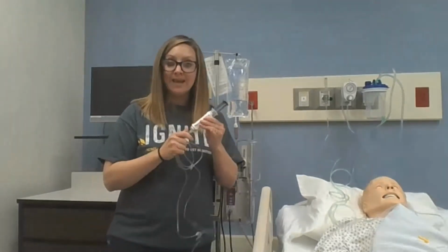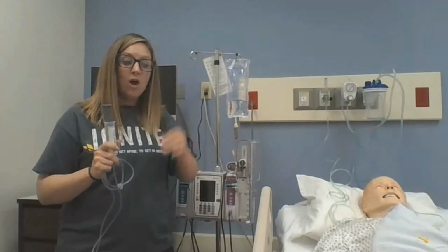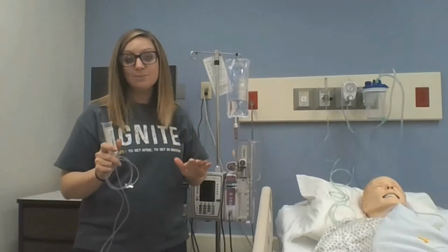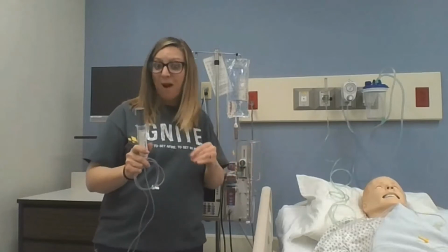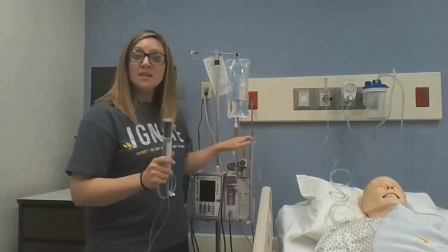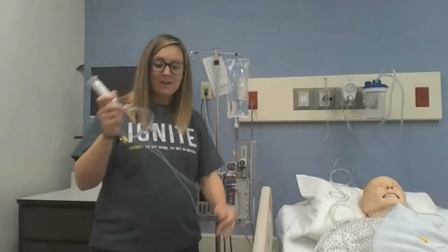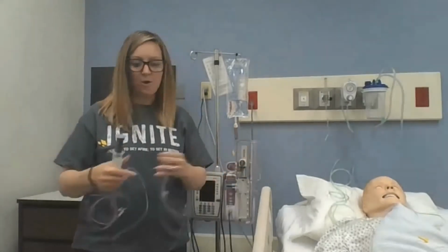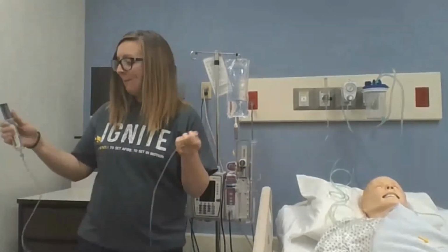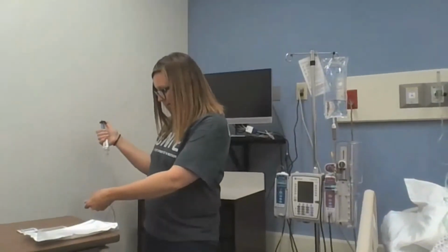You can manually prime these, or you can prime them from the pump. So it just depends on if you need to use very specific measurements. Maybe your patient is critical and you need to account for every last drop of that medication. Then you'll prime your tubing with your pump. But you can also manually prime it. Just make sure that you're not wasting any as you go. Okay, so if I'm manually priming this, we're going to just kind of put that down there.